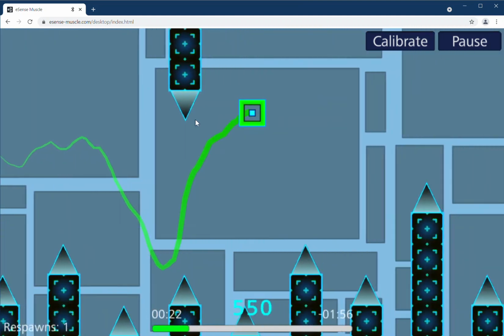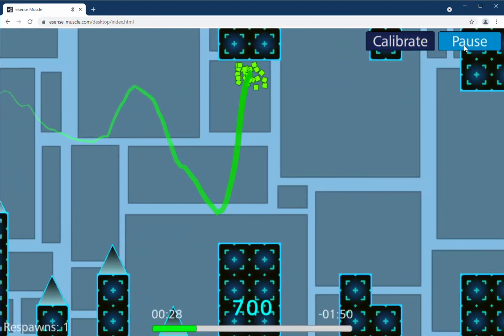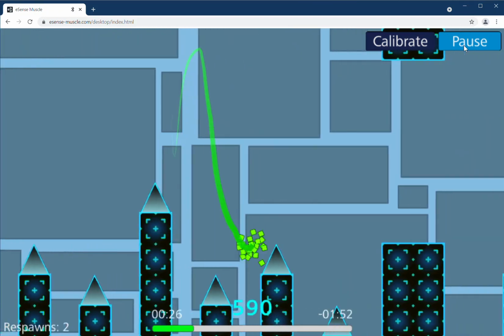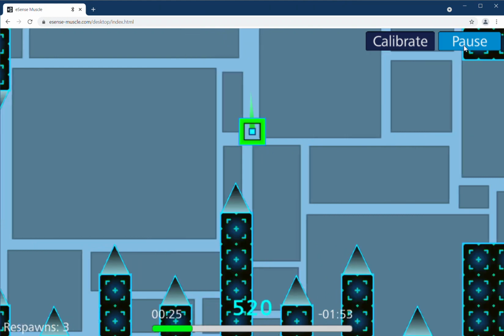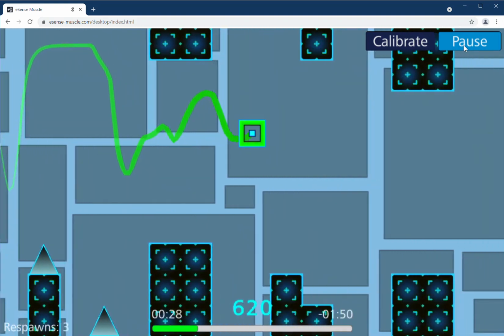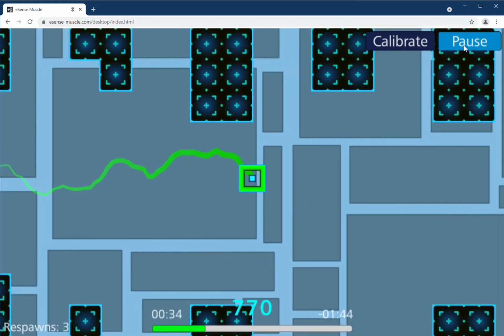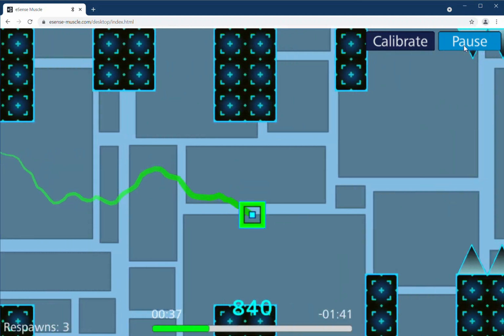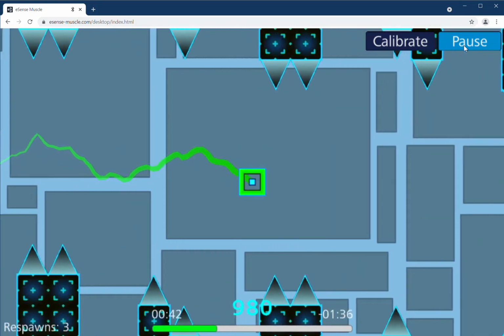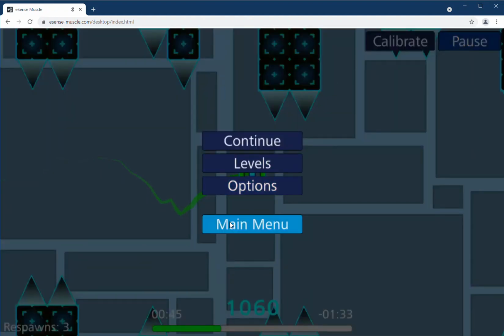You can even have more difficult levels where you need to jump at the right moment. But if you don't want to have these obstacles that are a bit tricky, then you need to choose from the other levels where it's only about collecting coins. So here I need to hold the muscles at a certain level, not to contract them too much, not to loosen them completely, to fly in between these obstacles. Okay, so this is the coins game, and quickly let's have a look at the ping pong game.